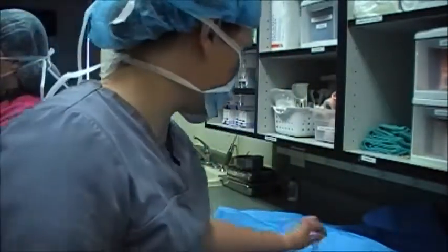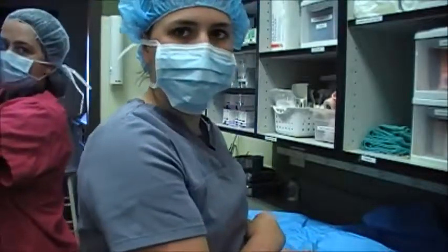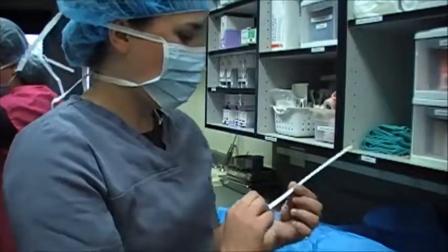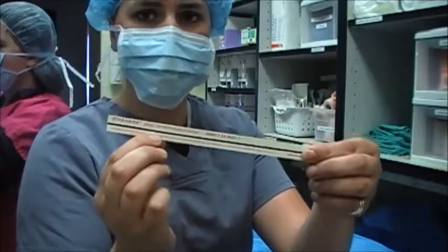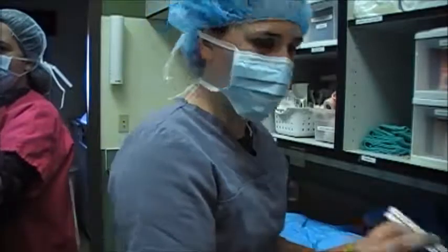As she's putting that on, I'm making sure that I'm out of her way from her sterile field as she puts her gown on. I can show the indicator strip that turns dark in the center of the line when it has been properly sterilized, so I have verification that the gown is sterile.